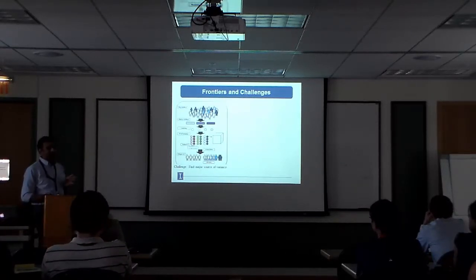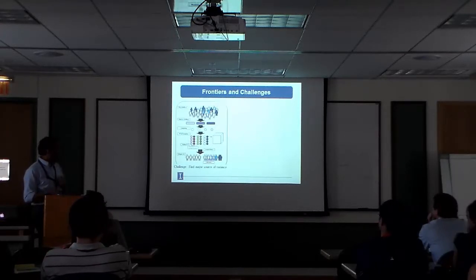So there's perhaps a better way to do this, and the way we tackle this problem in our lab is we've built up essentially an ANOVA model that tells us where the variance is, okay? So we can then figure out, is it a problem worth doing? If it is worth doing, then should we spend our time doing it, and under what parameters, what sorts of experimental conditions should we do that?